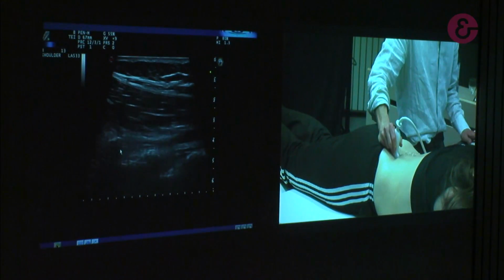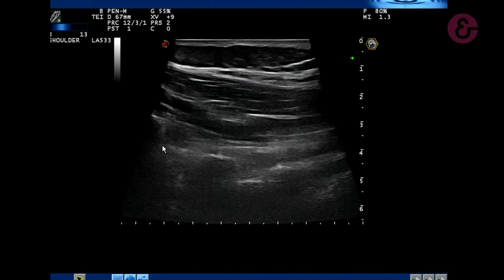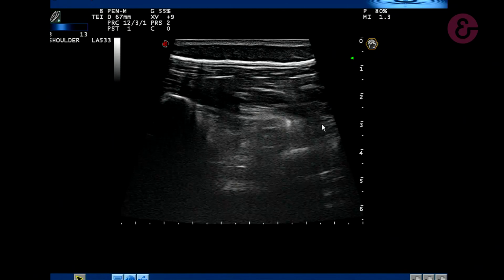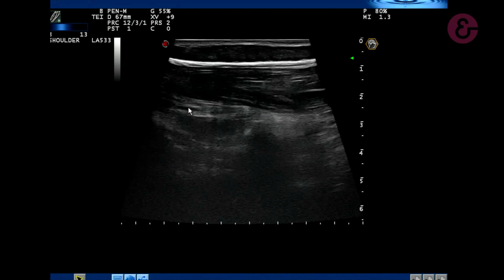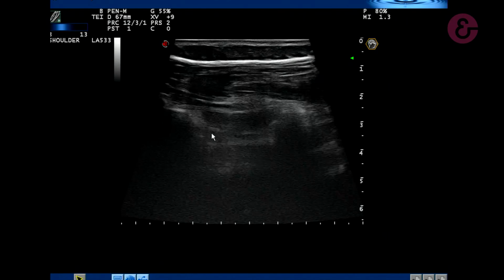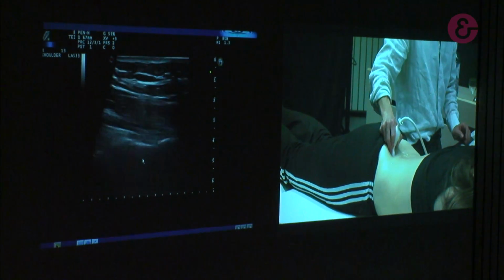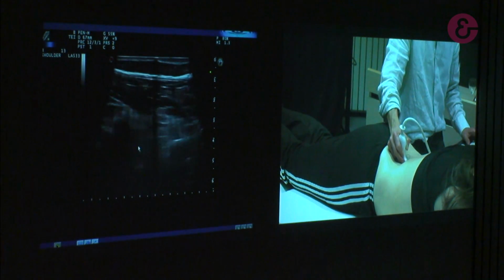Here we can recognize other bone structure, and this is the lamina of L4, so L5, L4, L3, and we can go up to L2. So now the lumbar lordosis is over, and we can start with the kyphosis. Here we can recognize the structure a little bit better. So lamina, L1, L2, and here is the joint. So I start again from the sacrum, and I will stop around L3.